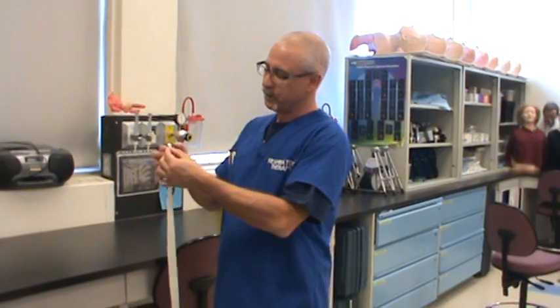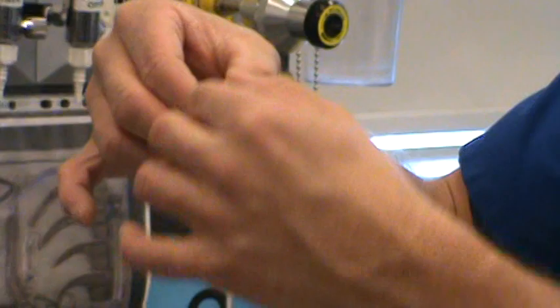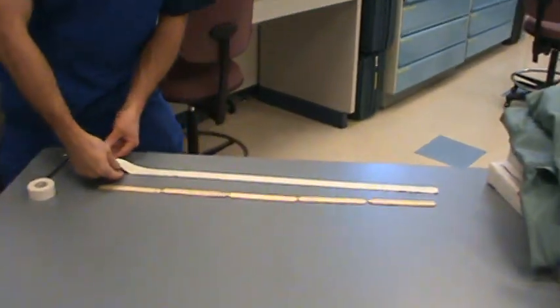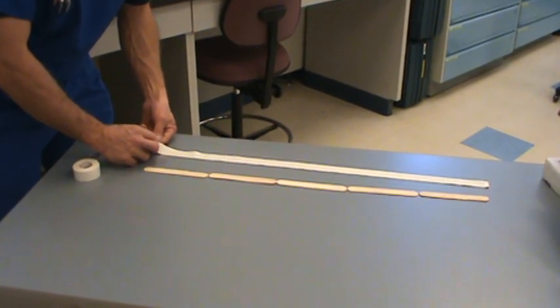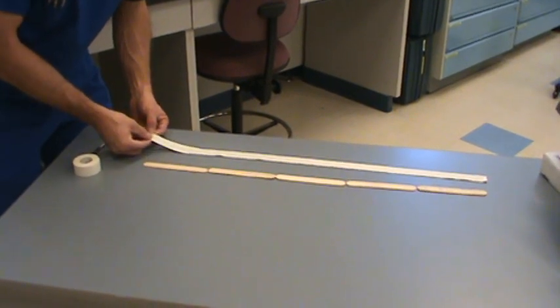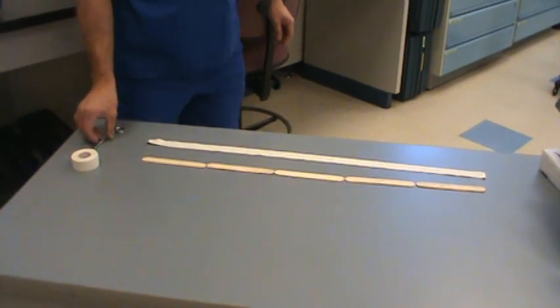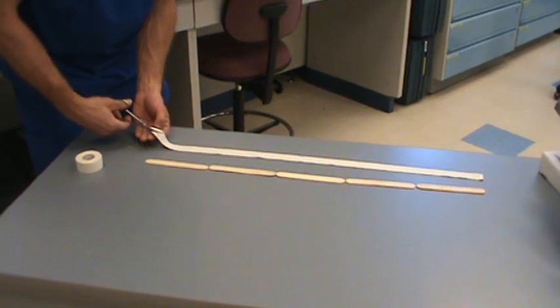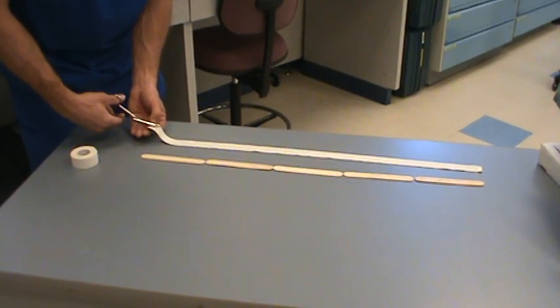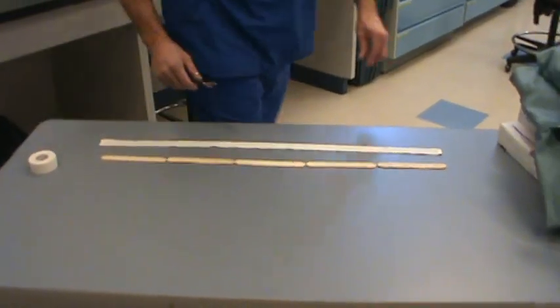Once you've got the tape torn, fold down each end about 1/4 inch. So I folded out the one on my left, your right. Now I'm going to fold the one on my right, your left. All I'm doing with this is making 2 tabs at the end of my tapes. The next thing I'm going to do is cut with my scissors through the tabs. The tabs simply allow me to hold onto the tape without touching the sticky part of the tape when I'm ready to tape the tube in place.